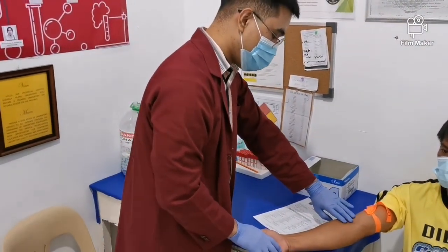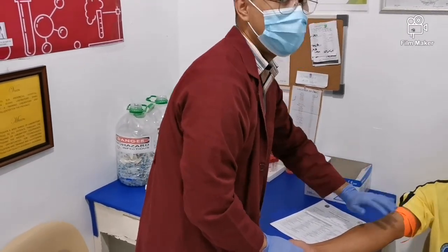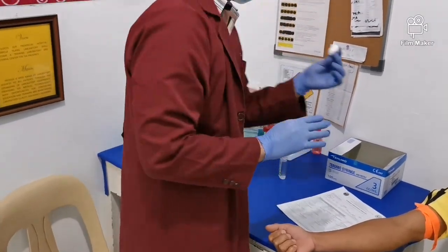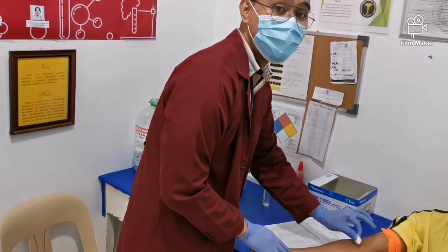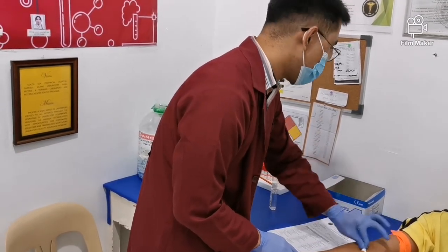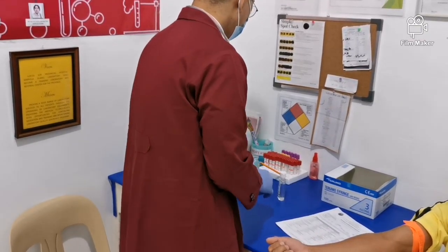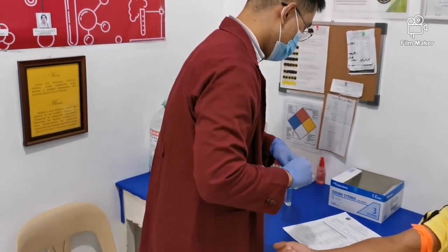Tanungin mo yung pangalan mo. Of course, the first thing you do is to palpate the vein. Hanapin mo muna. Then, kapag na-palpate mo na yung vein, disinfect. So noon, the proper disinfection is concentric. Pero yung nasa revised guidelines na ngayon, pwede na maraming direction. Actually, it is more effective na daw. And then, allow to air dry. I-dry natin yung alcohol. And then, let's prepare for our syringe. Prepare na natin.